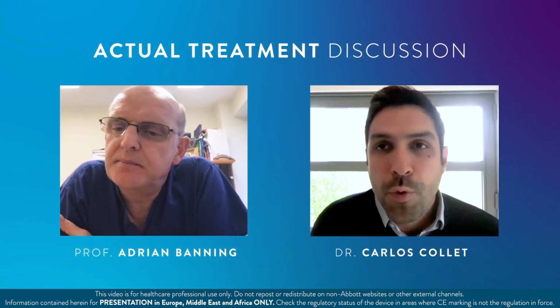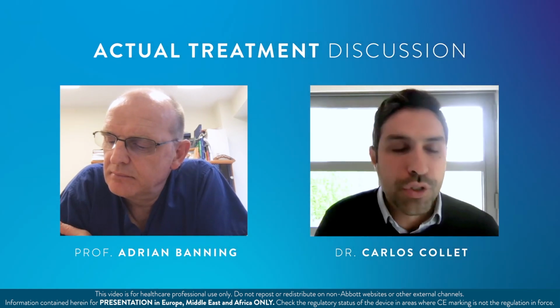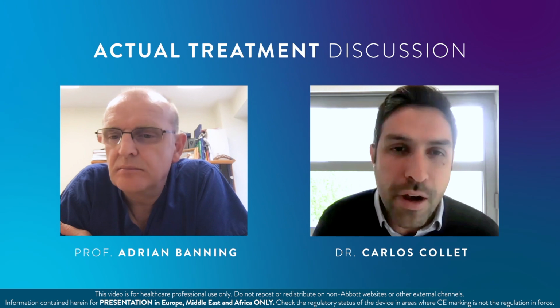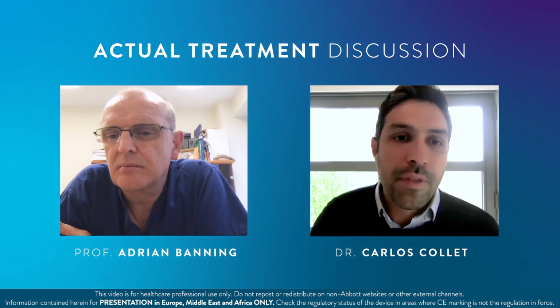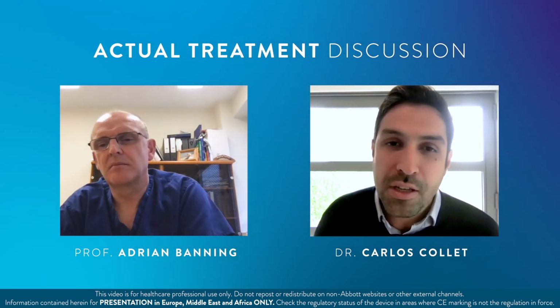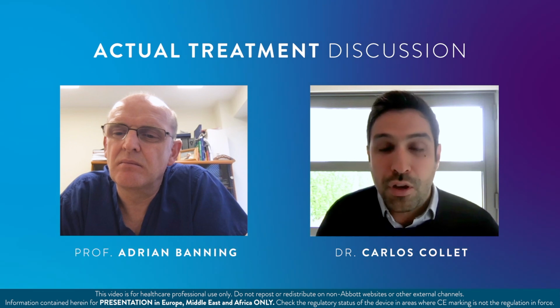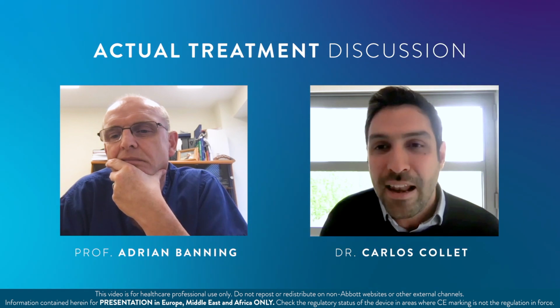So yeah, we're really happy with the results on the main branch, and just to give a summary of the levels of decision in this case. First, we identified that it was neointimal hyperplasia. Then we were confident to use the drug-coating balloon. Then came all the technical difficulty of the procedure, but we finished with an OCT that showed a very extensive dissection. And as you mentioned, Gabor, the length of the dissection was extremely important for us to select the length of the stent.